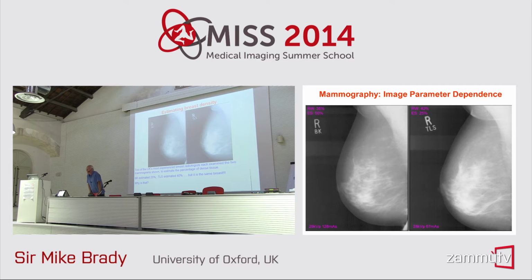That's a problem, right? It says that the contents of the breast were confounded by whatever it was that took the image. Right? This one was in fact exposed to x-rays for twice as long as that one was.